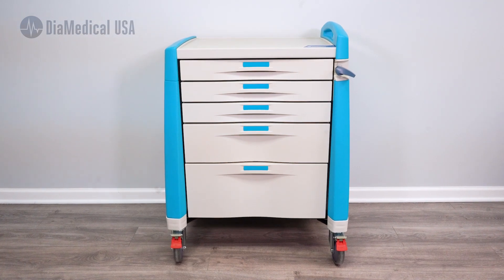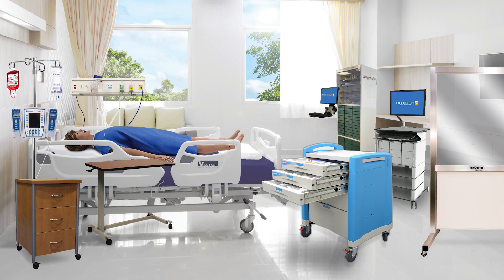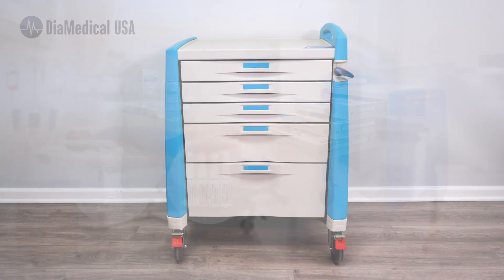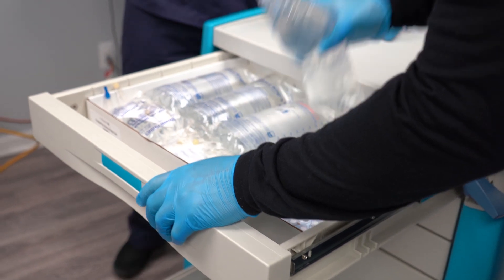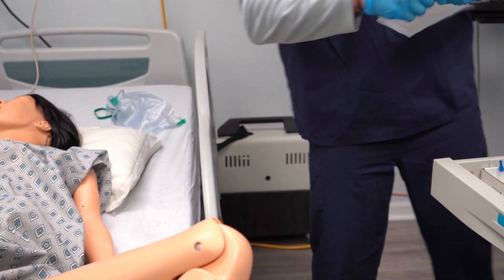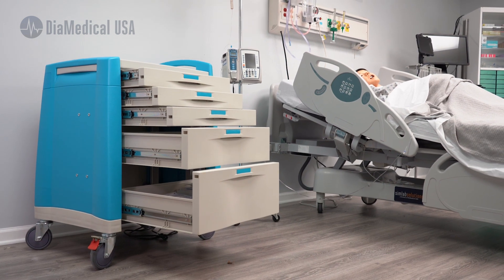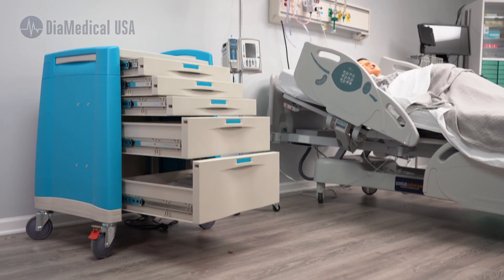The SimLab Solutions 5-Drawer Postpartum Hemorrhage Cart is a hospital grade medical cart filled with simulated medications, equipment and emergency medical supplies. This cart is ideally designed for postpartum hemorrhage training with nursing students as well as in-services and continuing education for OB clinicians.